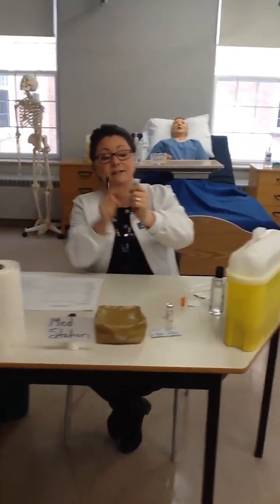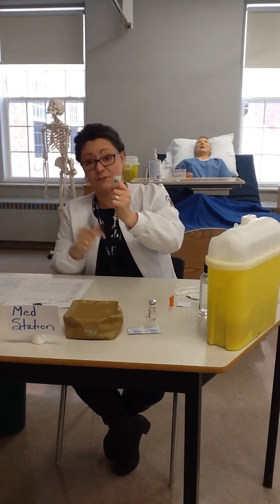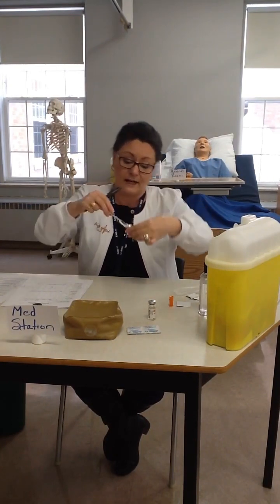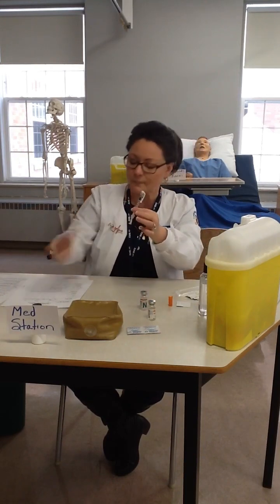She would do that math in her head again and say, okay, June has insulin N P H. That's what the MAR says. It's 14 units. I watched her draw up the 6. 6 plus 14 is 20. She has the right dose there. So that's my second nurse checking my work. Absolutely essential. And so now I'm going to do my third check.